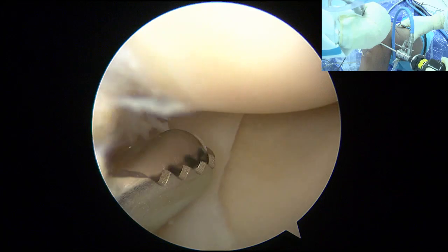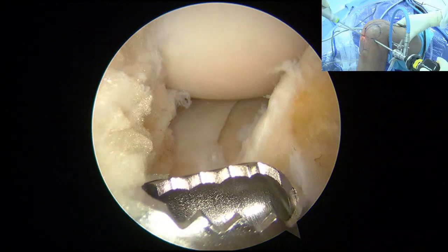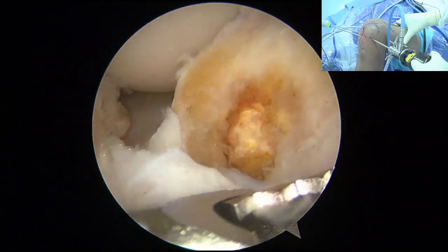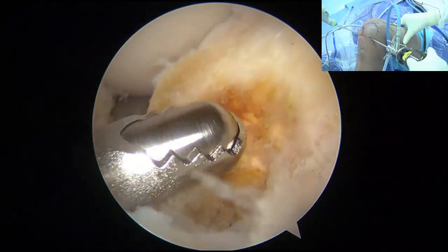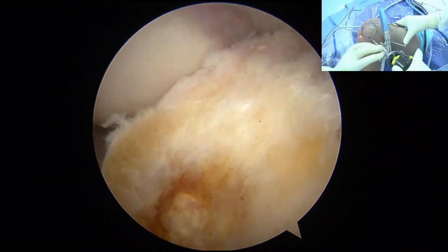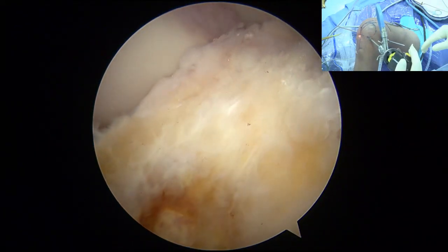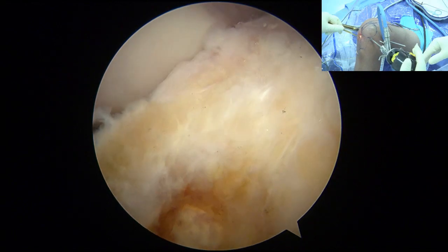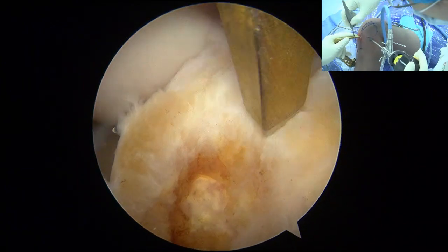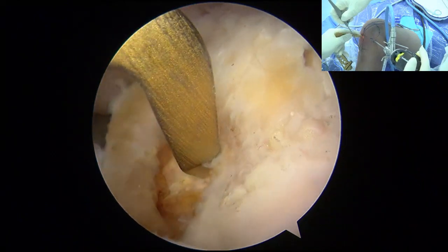Okay. So intermeniscal ligament is connecting from here, see? 是这一个走向。Yeah, here intermeniscal ligament. So your tunnel has to be here, okay. ACL 在这里 aiming device. 瞄准器。 So in Thailand we prefer the elbow type, but in China you have the tip type, right? That's fine. So we can modify a little bit. This is the tip type, right? So we put it here, okay, in the center.